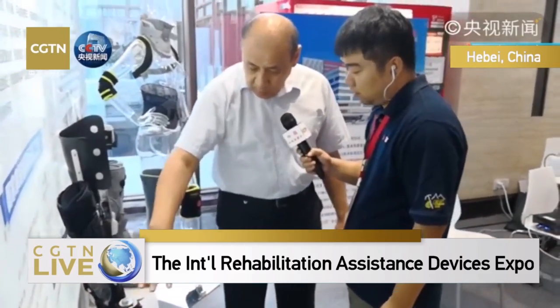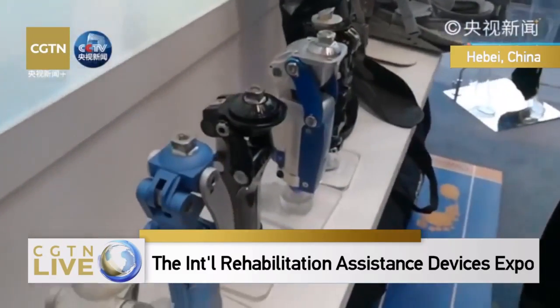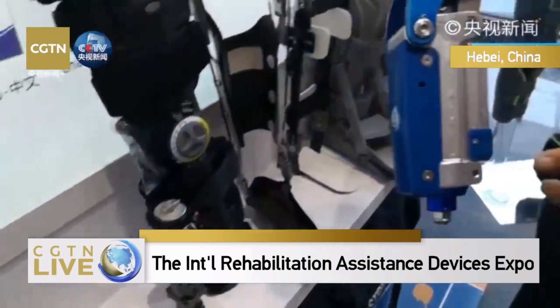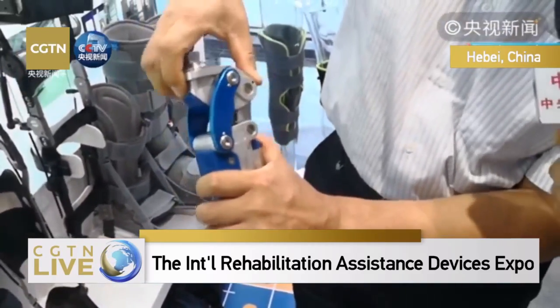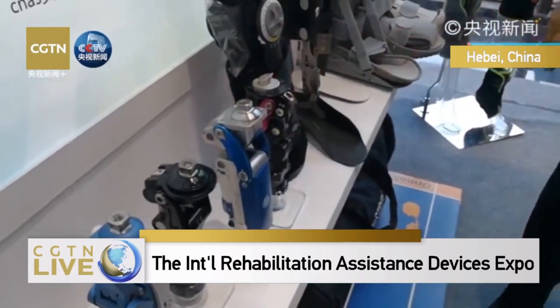So what are the materials used to build this device? This product per se is using a titanium composite. It's quite light, and at the back there is also steel attached to it.